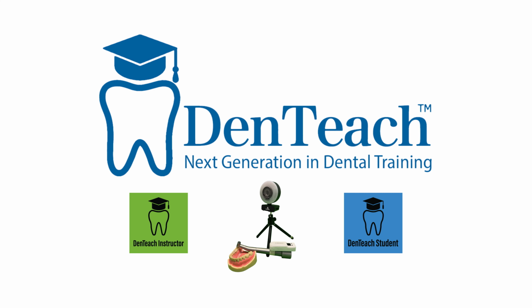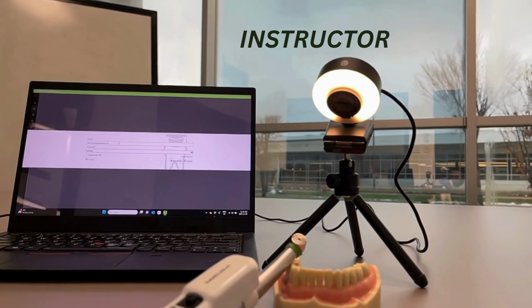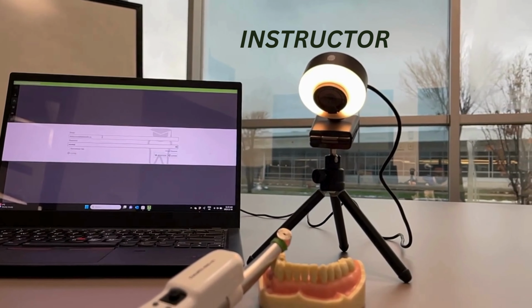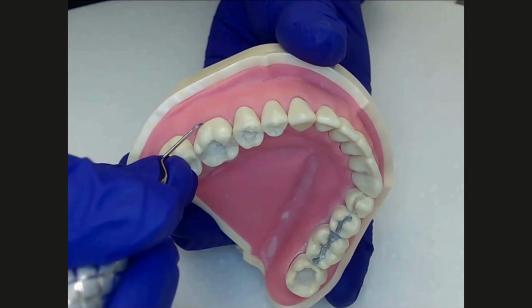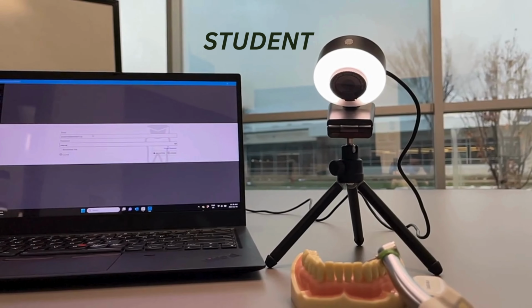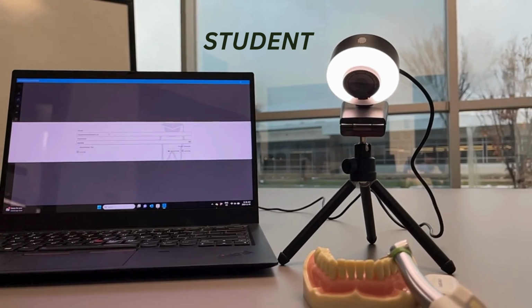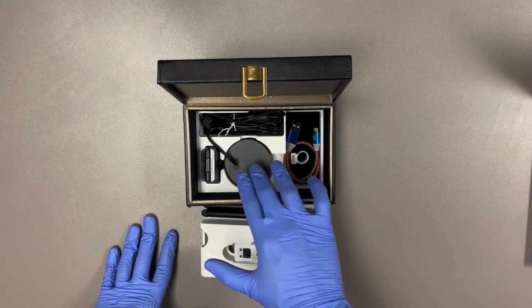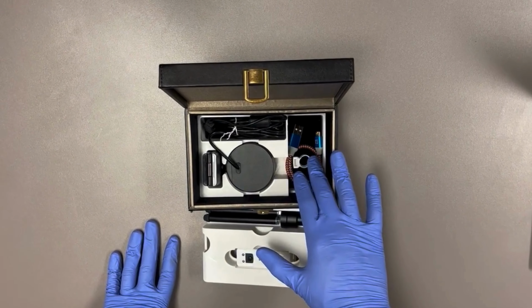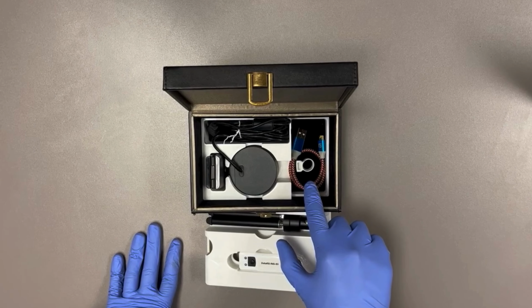The DenTeach Basic Edition Package is designed with a compact layout, ideal for students embarking on their dental education journey. It comes equipped with all the necessary tools for students to hone their skills and techniques, paving their way to become accomplished dental professionals. Included in the package are essential dental training items, an adjustable camera, and a real-feel sensor that captures the user's hand motion characteristics.